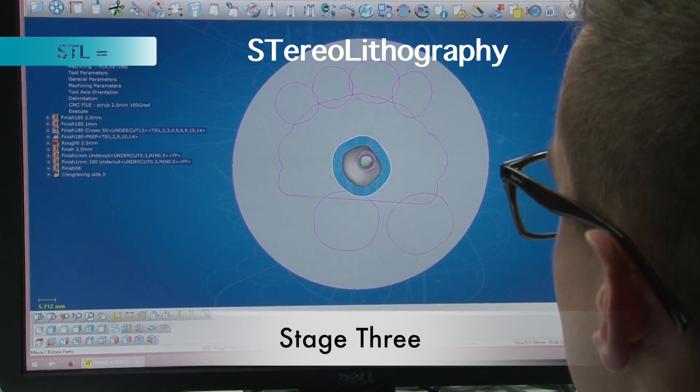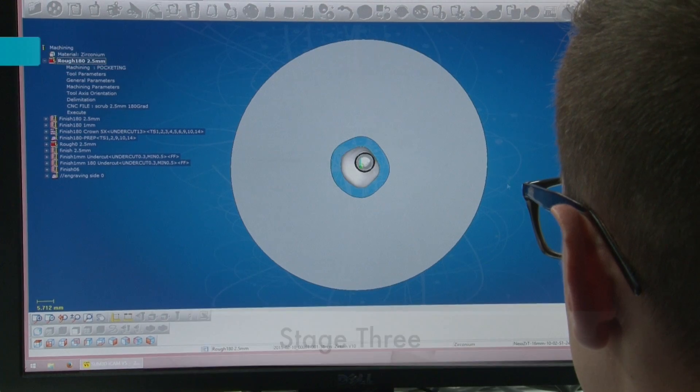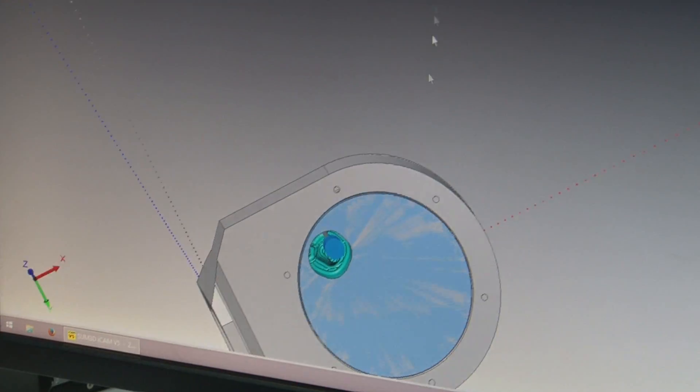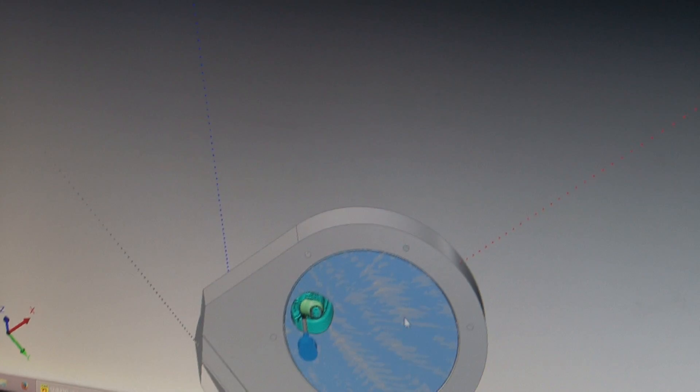Next, the STL file from CAD is imported into CAM software — computer aided manufacturing — where the restoration is placed in the zirconia disc and calculated to the ISO file.